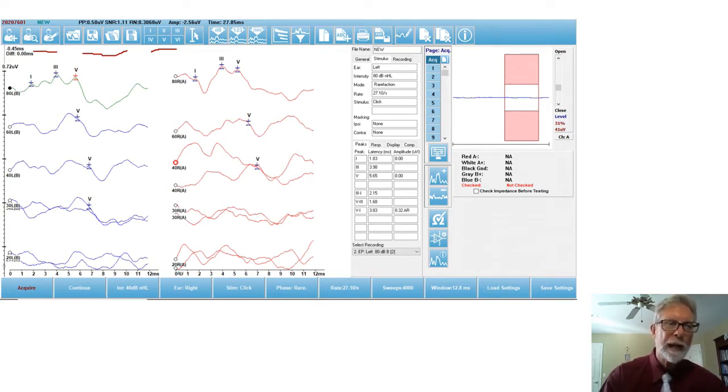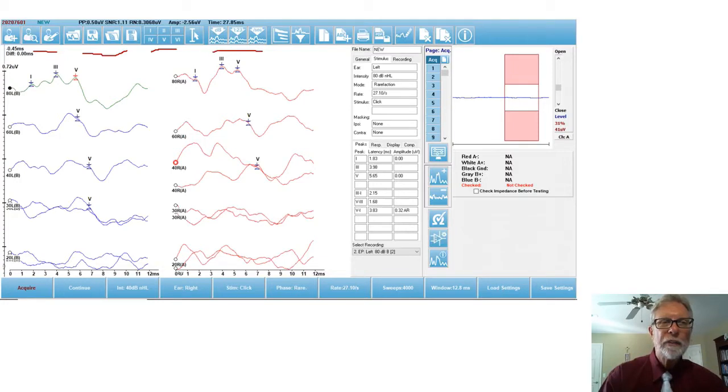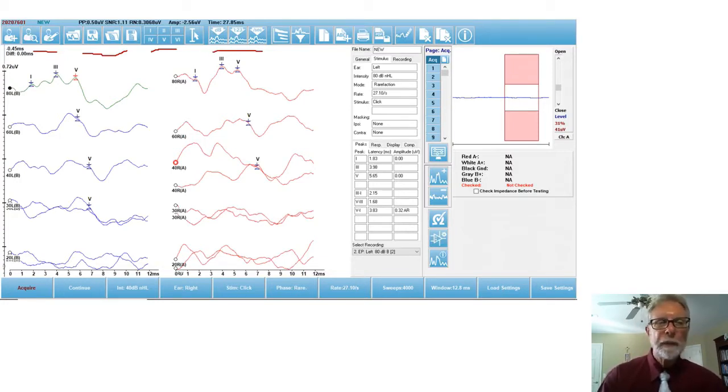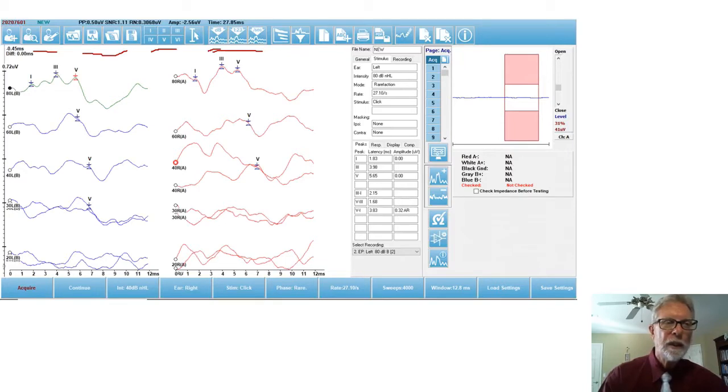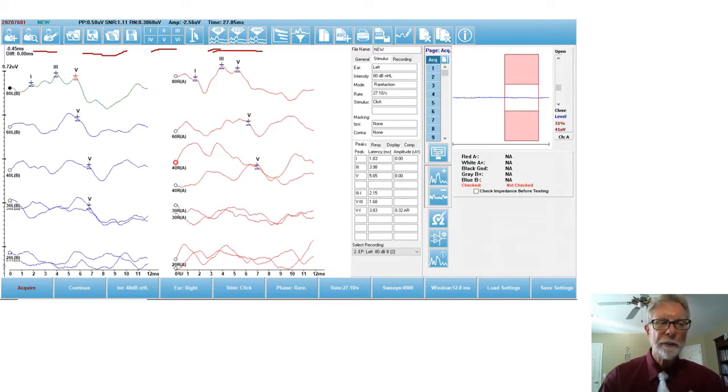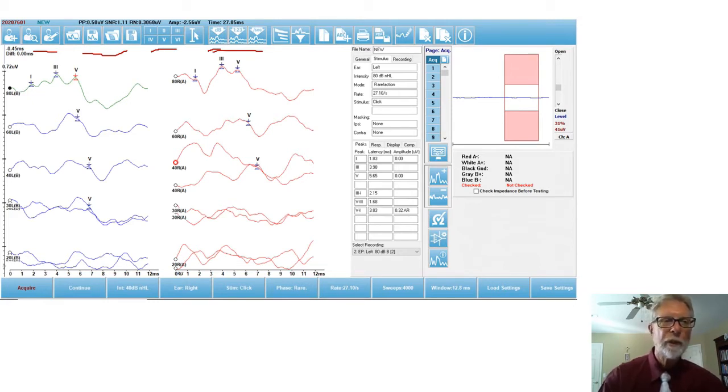We make a waveform active simply by double-clicking on it. These are very convenient icons because it's what we use to automatically arrange the waveforms. I used this one right here in order to arrange my waveforms in the order of the level from a higher level down to a lower level.